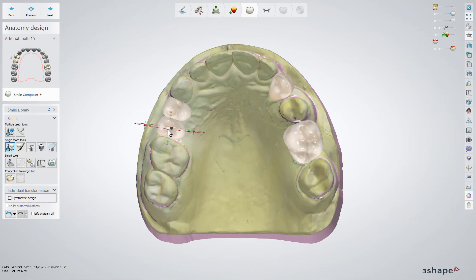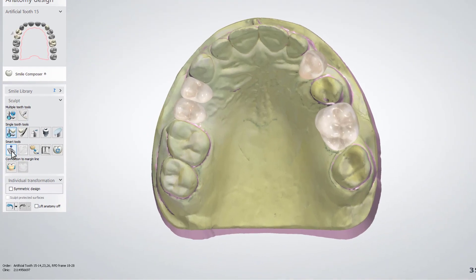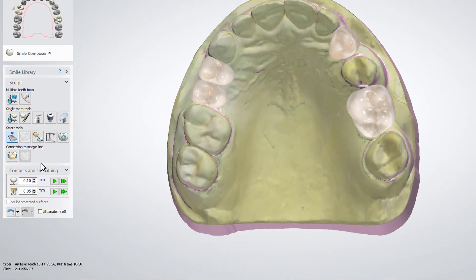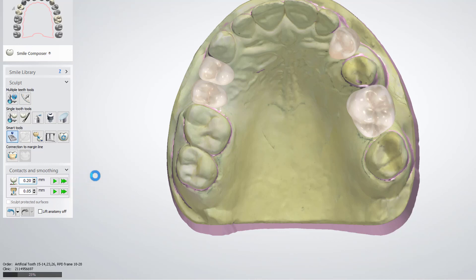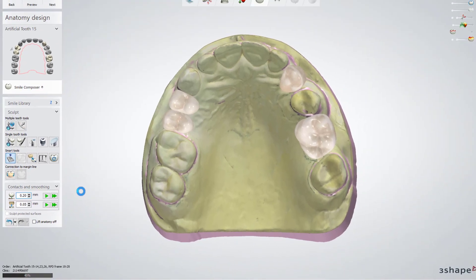While at the anatomy design step, place the teeth in the correct position and use all the available tools to do so. After placing the anatomy from the smart tools, use the contact and smoothing tool and adjust the distance from the anatomy to the model. Do this by setting up the parameter and pressing play or play to all to apply it globally for all the teeth.